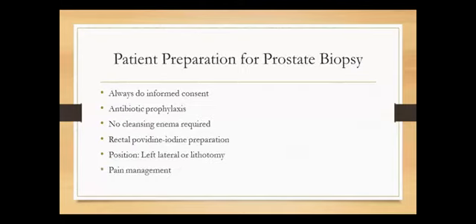So how do you prepare a patient for prostate biopsy? We always start with informed consent. You tell the patient, this is what's going to happen. You're going to lie on the bed. We're going to do this and this. The possible complications include infection, bleeding, blood in the urine, stool, hematospermia, and then you also go on to give the patient antibiotics.